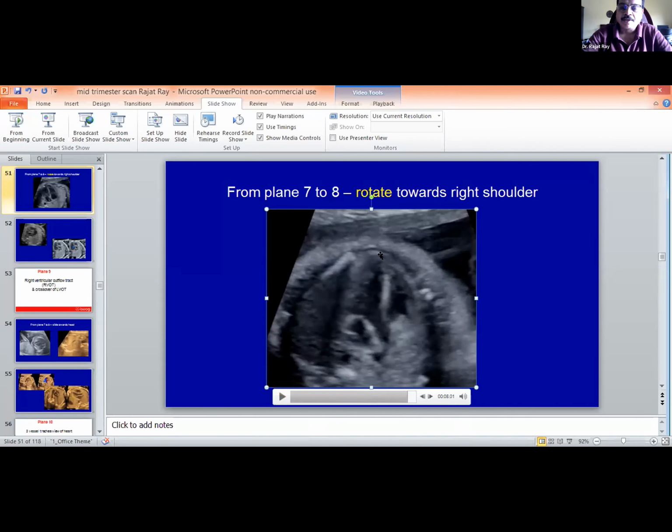And if you mark, there is a continuity of this aortic wall. One wall is continuous with this interventricular septum. This is called septo-aortic continuity. And another wall is continuous with this mitral valve. So if it is continuous, you are ruling out VSD, membranous VSD, and other anomalies.